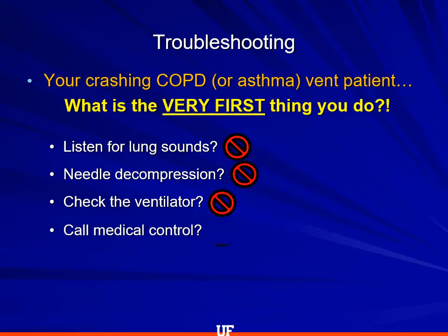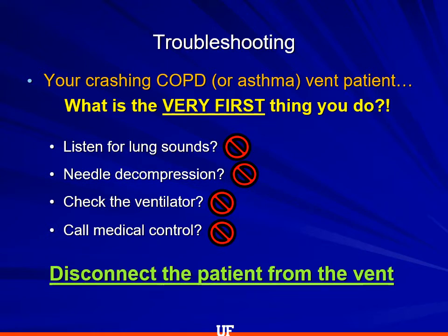No, absolutely no. The first thing you do every time is disconnect the patient from the vent and open that ET tube up to air and let them exhale. Because what's really likely is they were breath stacking. They had air that was being forced in that they just couldn't get out. And if you let them exhale, a whole lot of the time, you're going to fix what's wrong with them.